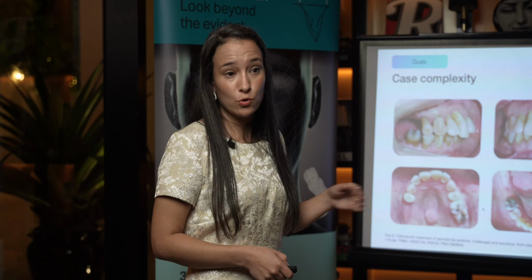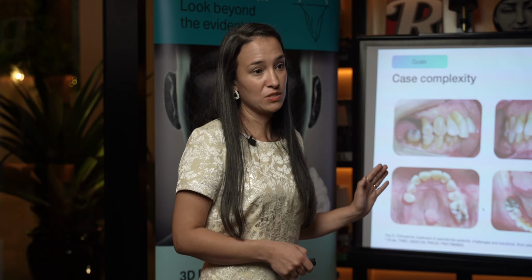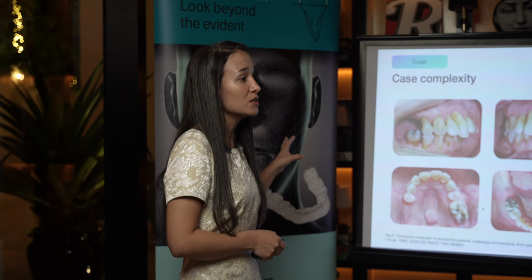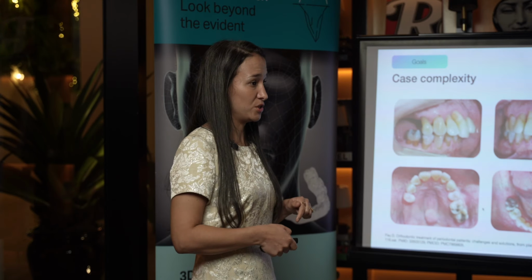We will let you know. You can submit this case by all means, but I would not make promises to the patient, because we will have to calculate if we have the anchorage we need to move the other teeth to get to the goal that you're trying to achieve.